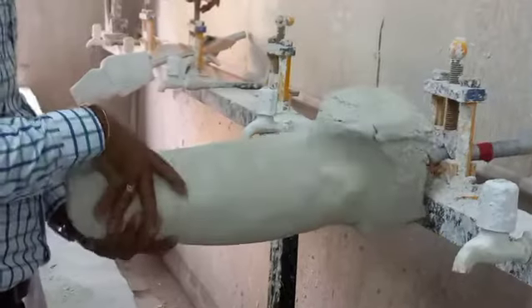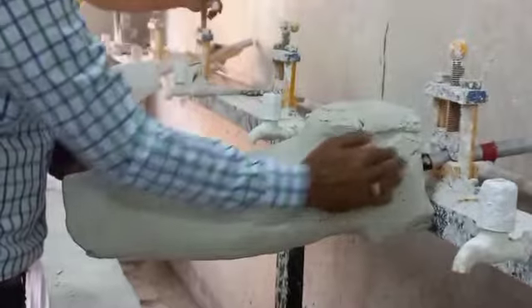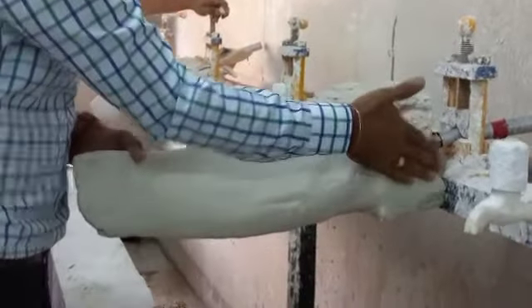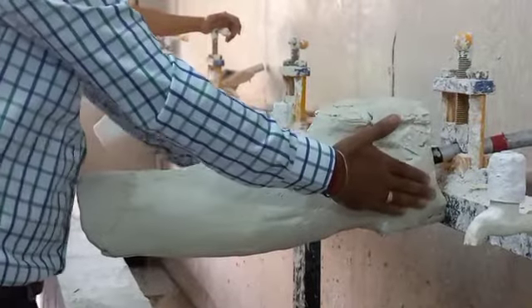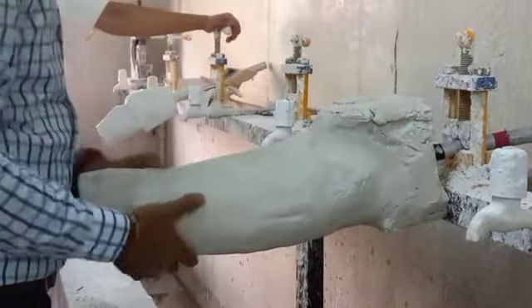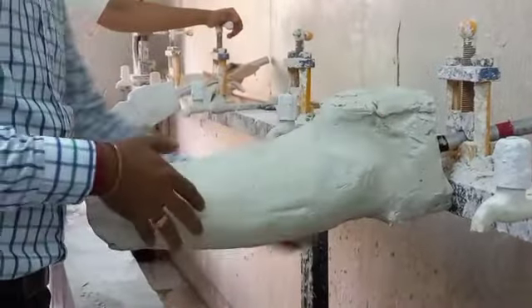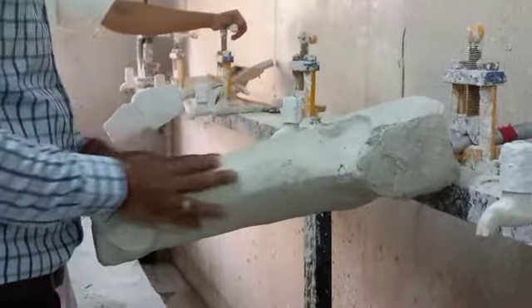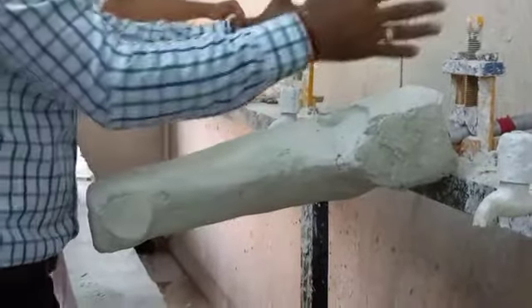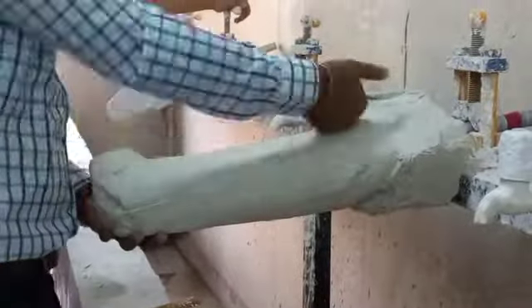The last class clearly. And the other wall, which is the lateral wall, is already a high wall, so we will require only a partial portion of it to be made parallel with the medial wall, right? Otherwise, mainly the anterior and posterior walls are going to be perpendicular to our main reference, that is the medial wall. We have not yet started any modification in this. We just had done a little bit of modification. We have started with this, right?